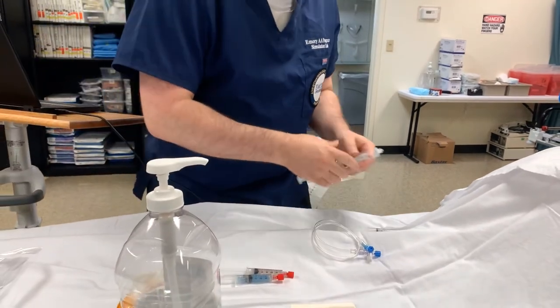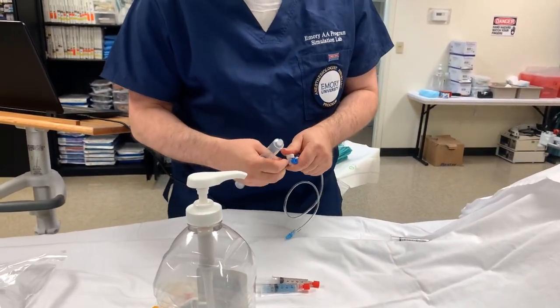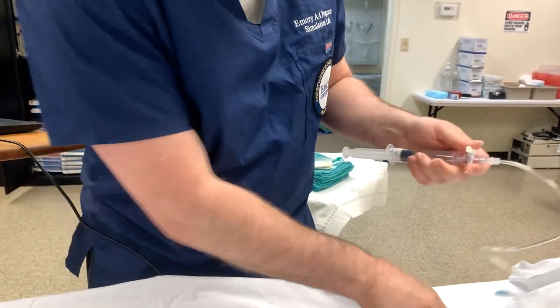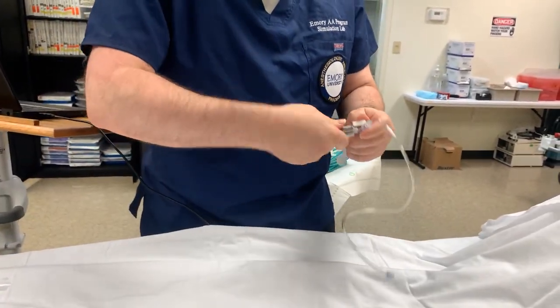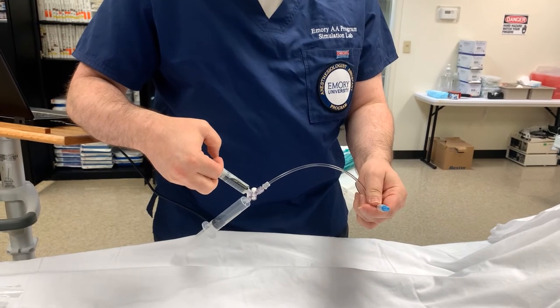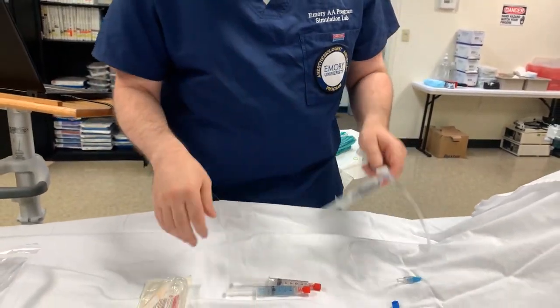I'm going to go ahead and prepare my anesthetic here. This is done non-sterile, and this is going to be handed to me during the procedure by an assistant, but I'll have it ready in the meantime. So we're going to load up the local and a flush syringe, and I'm going to go ahead and prime the line. We'll turn that off and have that ready.